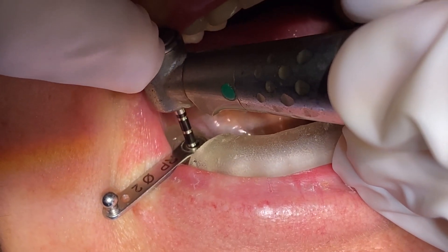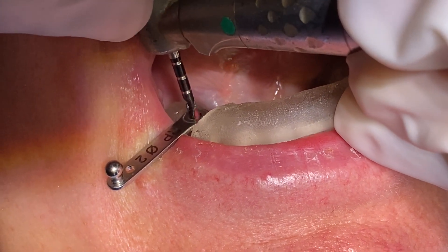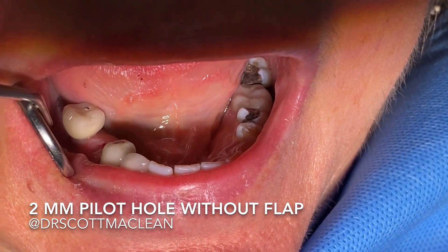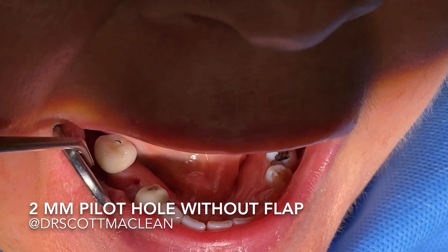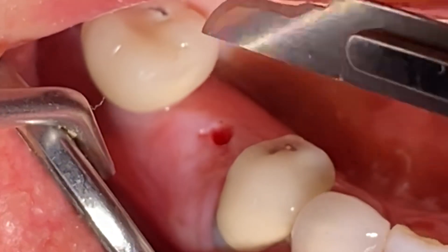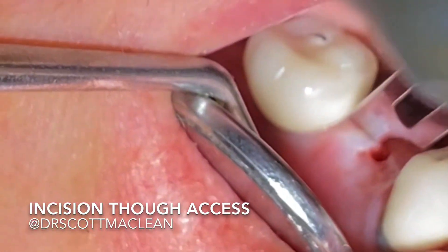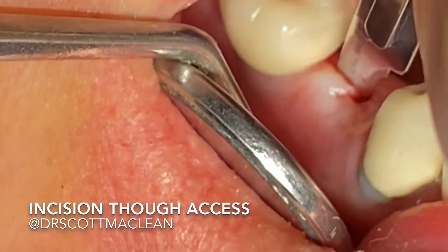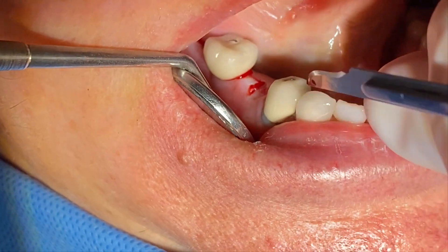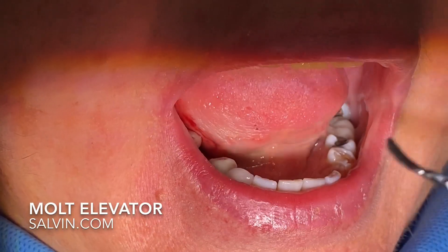Once we get the 2mm twist drill down, we're going to stop here and then just assess the situation. We'll remove the 2mm twist drill and go in and have a look. All I have is the osteotomy through the tissue — I haven't punched anything at this point. I'll take a 15 scalpel blade and make an incision right through the osteotomy. I'm going to cut it in half, and when I cut it in half, I'm going to flap just the buccal aspect of the tissue so I can maintain that soft tissue.